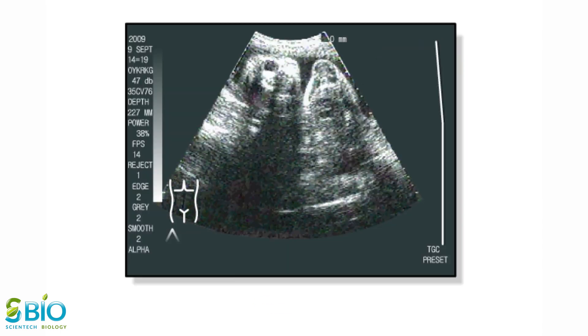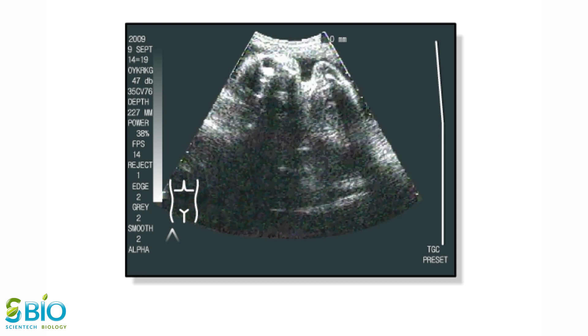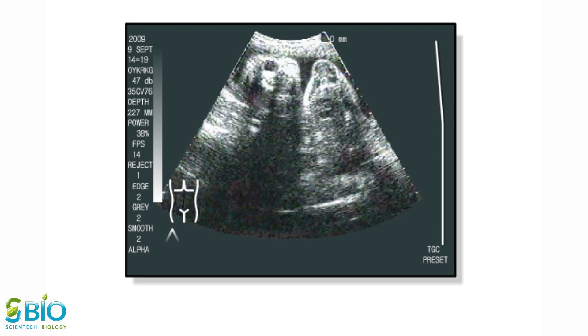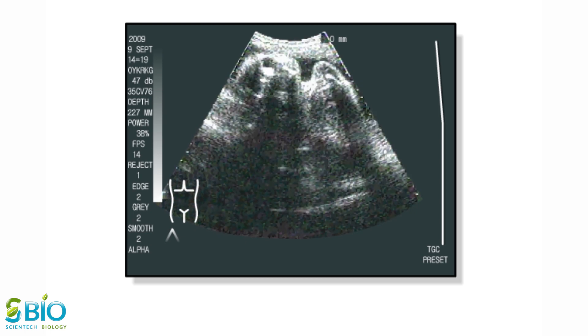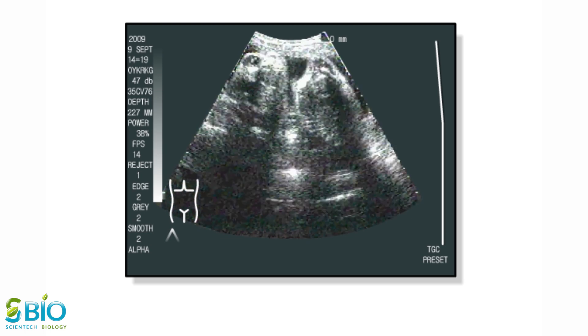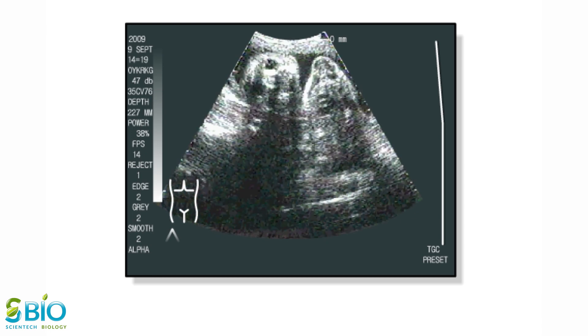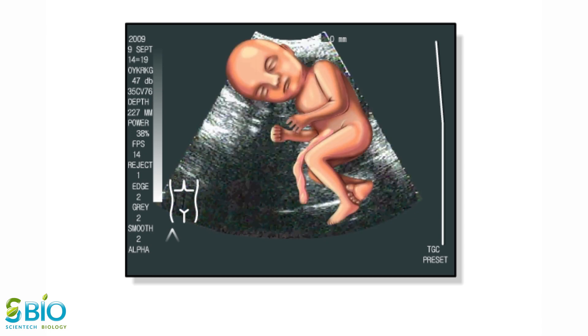In an actual ultrasound of a baby in a uterus, the solid structures in the baby's body are transmitted back to the monitors as white or grey images. As the baby moves back and forth, the monitors show the outline of the head. The eyes show as a dark spot in the head. The region of the brain and the heart are also shown. Remember, ultrasound only shows flat images of the body. A superimposed illustration of the fetus shows how the fetus actually looks in the uterus.